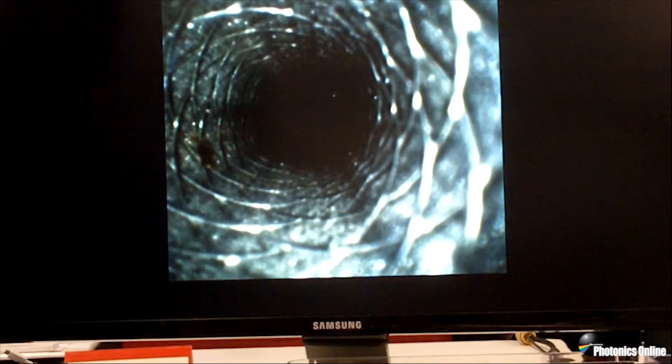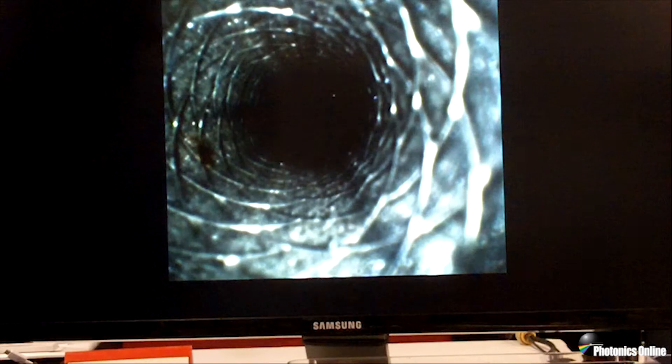We don't know exactly what this is, but this should not be going from patient to patient. So in this instance, the scope could go back for additional cleaning to try and remove the visible debris.